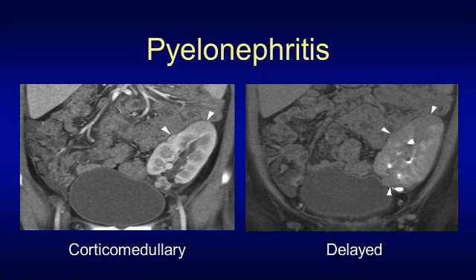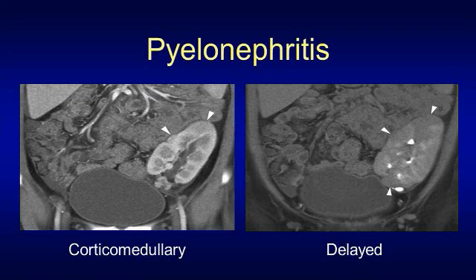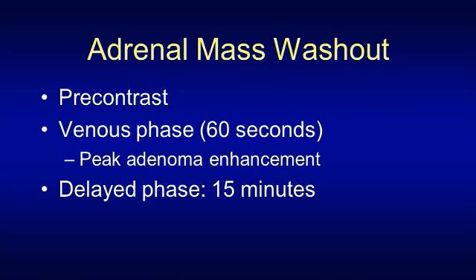Pyelonephritis is seen better on the venous phase than on the corticomedullary phase, but on the delayed phase we really see the bands of decreased enhancement very well, as shown in the image on the right. If we had to select one phase to image pyelonephritis, it would be best seen on delayed phase, but in most cases we are looking at a venous phase in a patient with abdominal pain and we should see the pathology well.